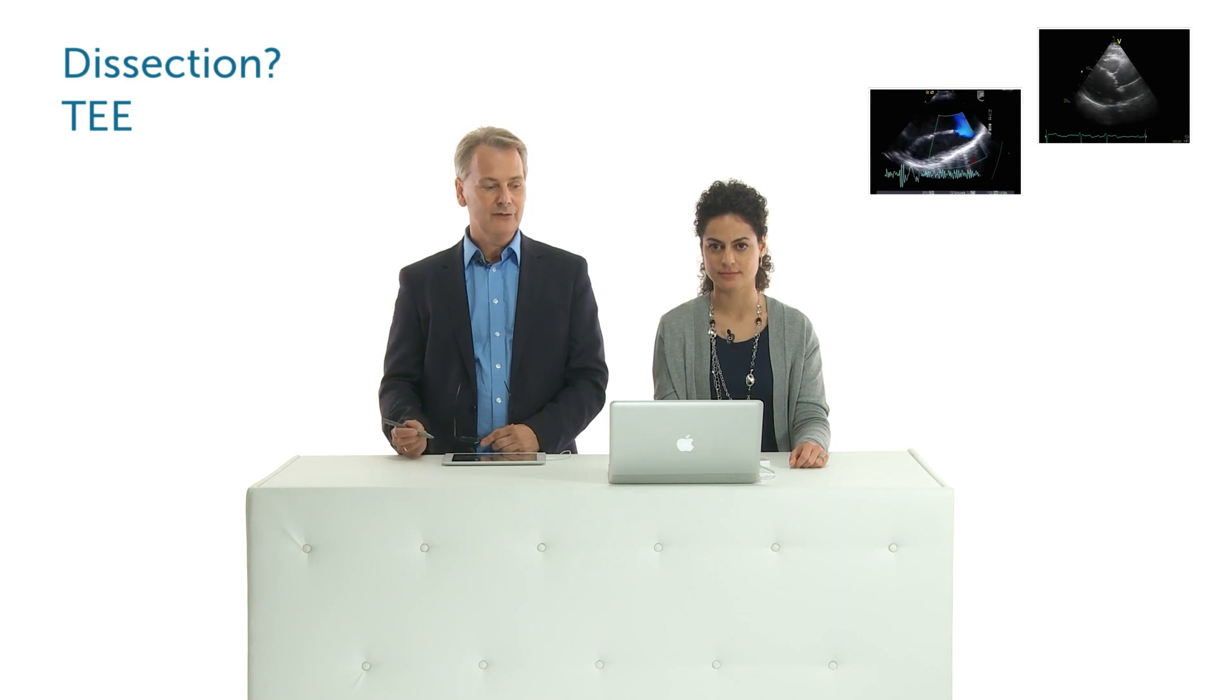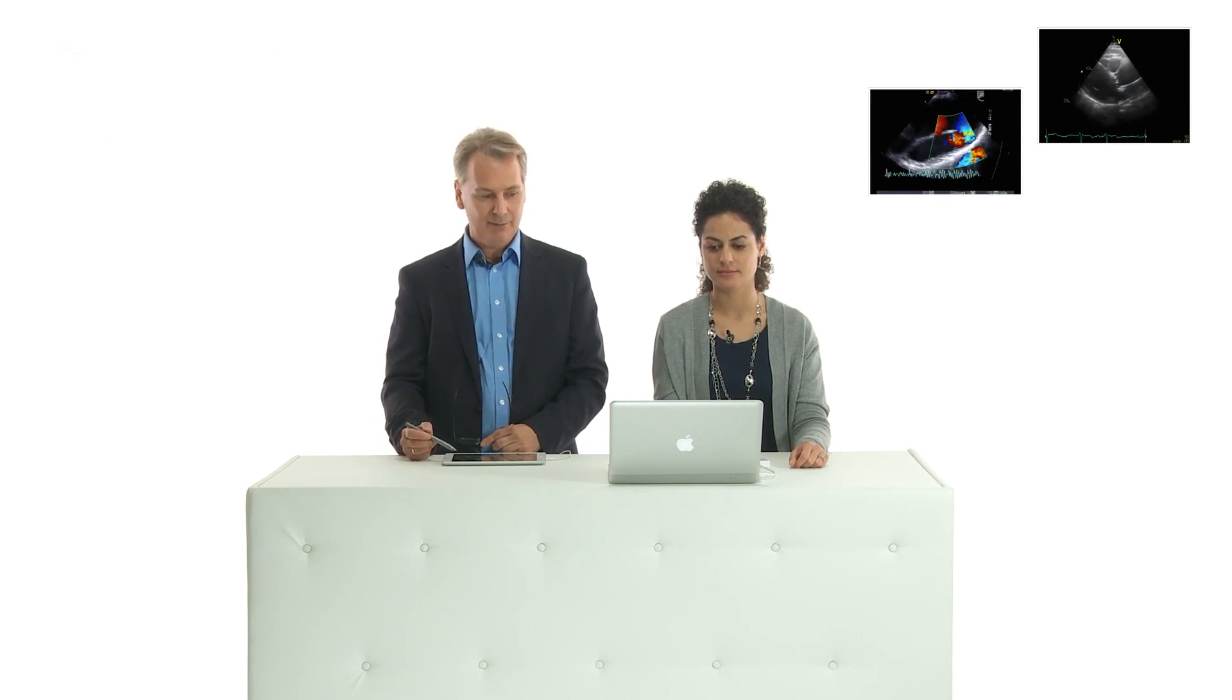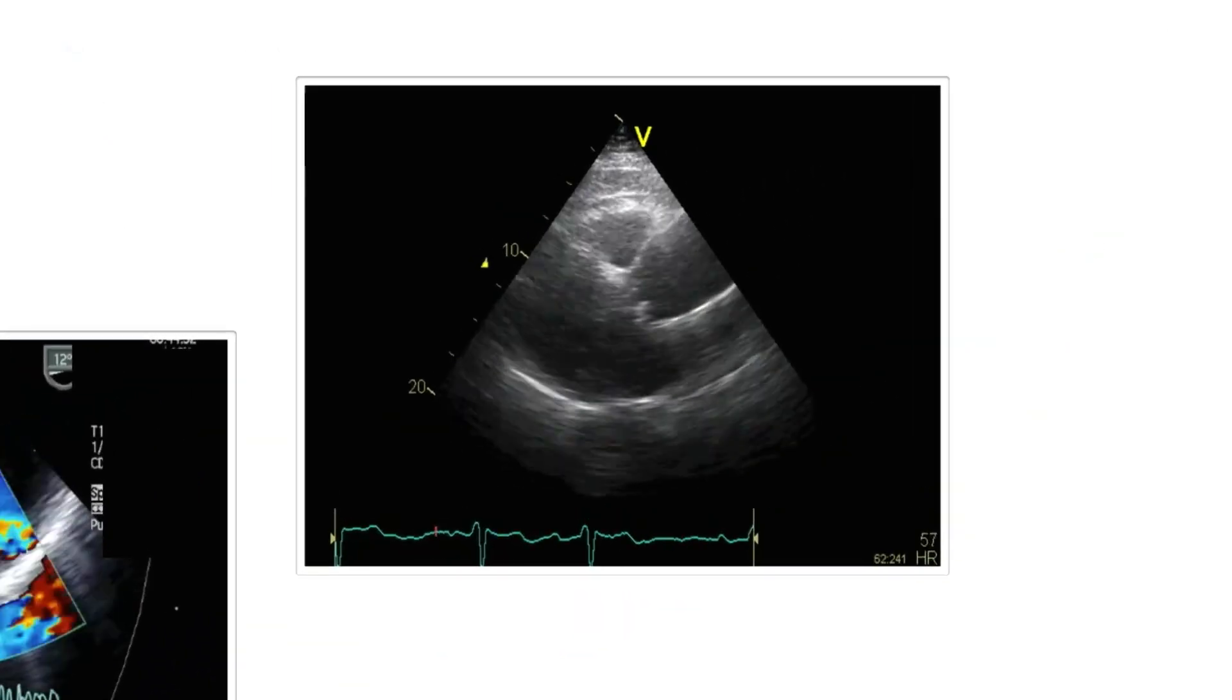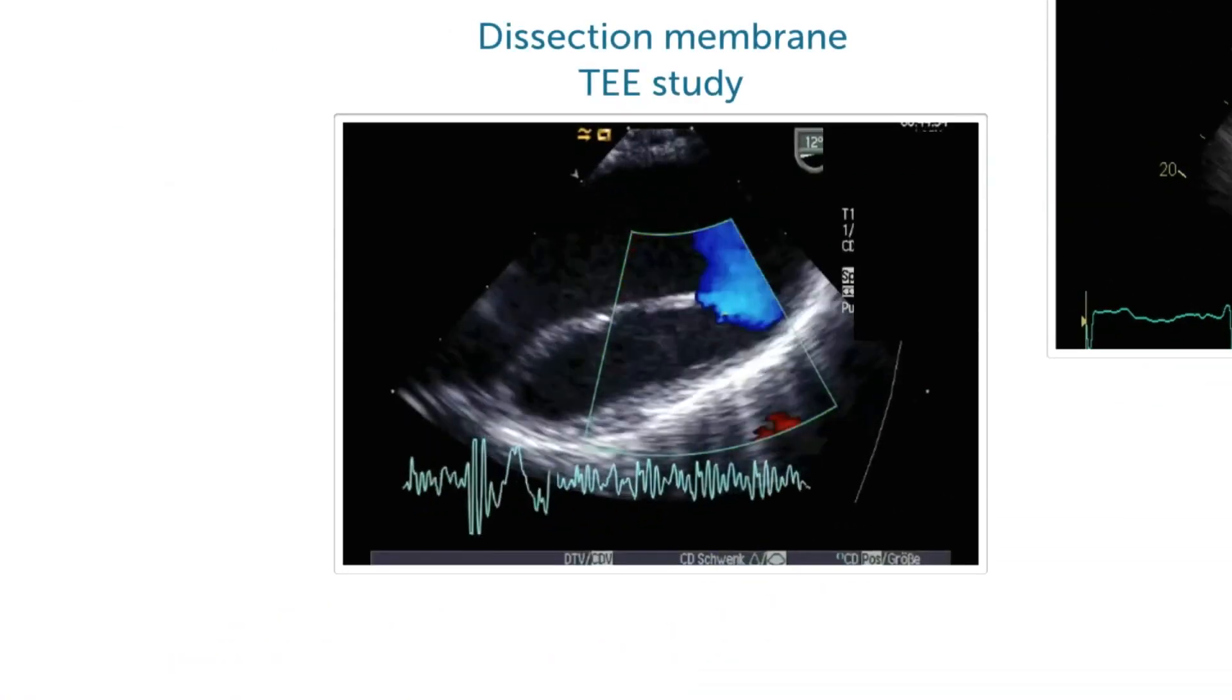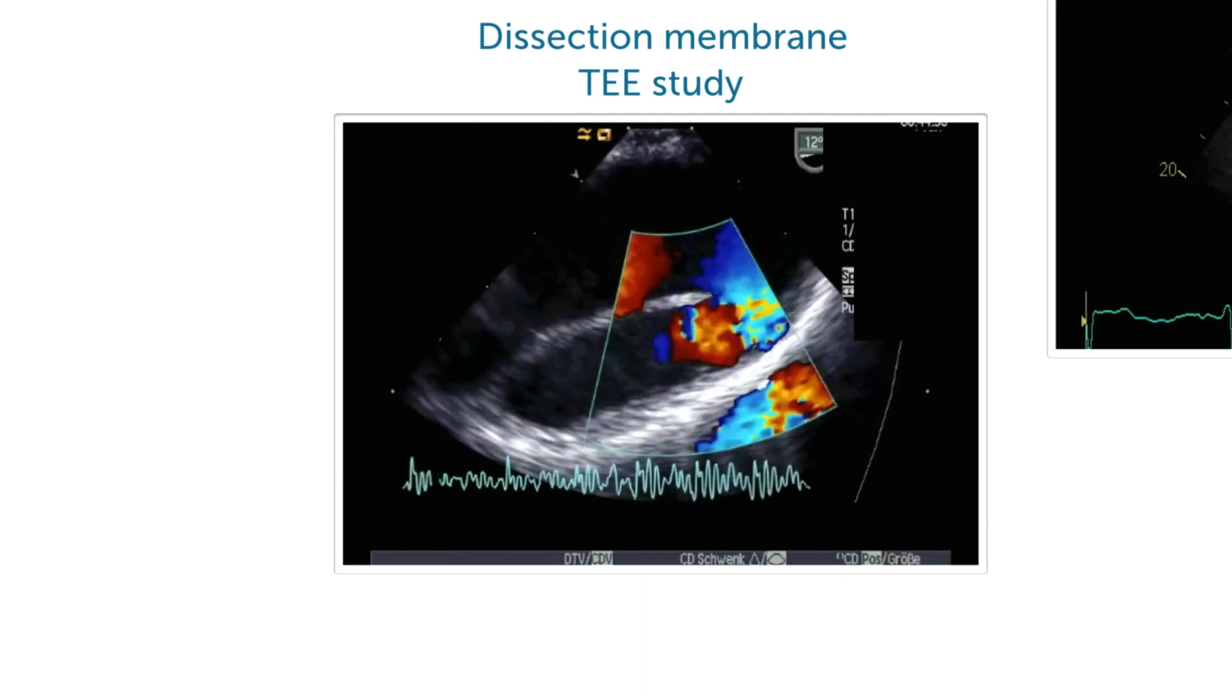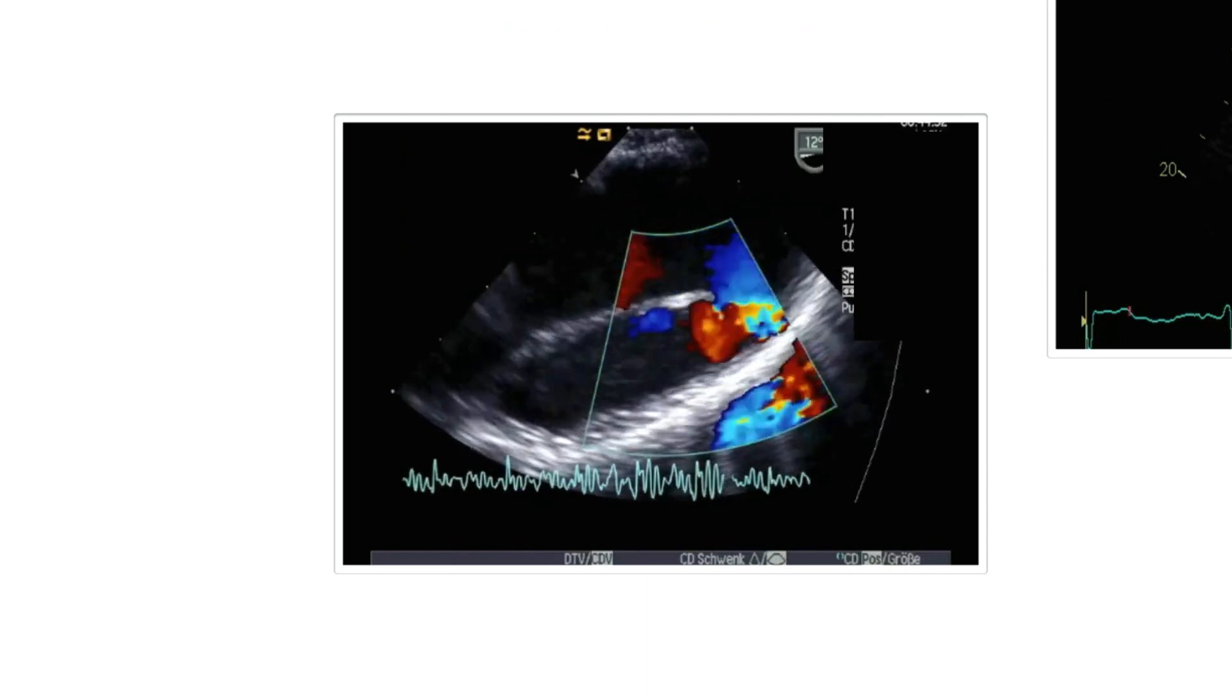But when we come to echocardiography, I think one of the major advantages is that we can suspect dissection already from a transthoracic echocardiogram and we can see things, for example such as here on the left side, where we have a dissection membrane and we can see the entry site and even the exit site of a dissection.